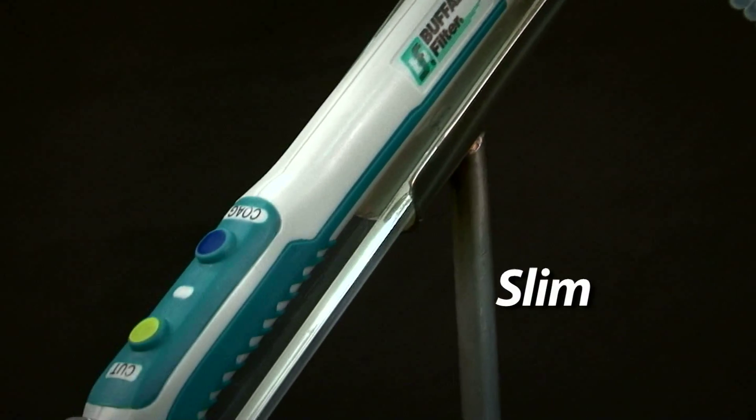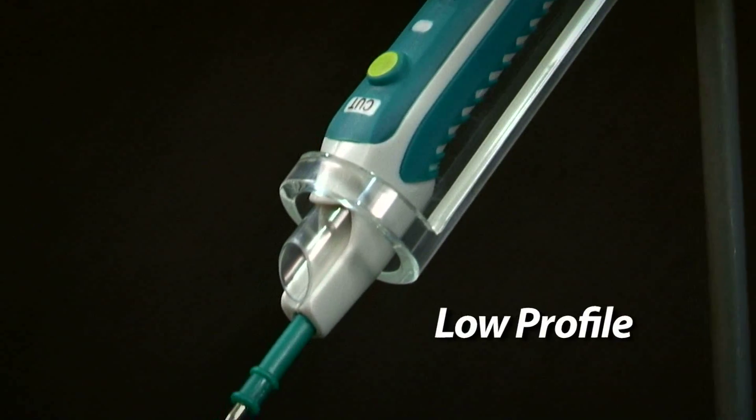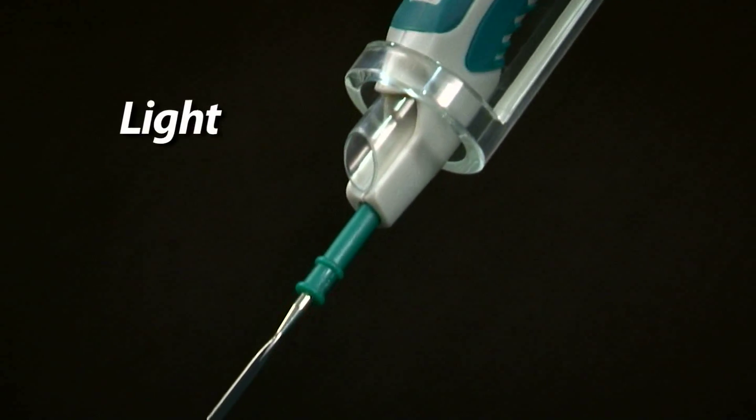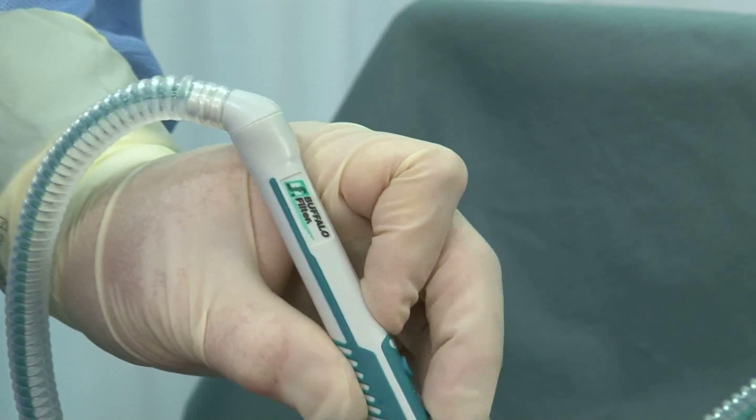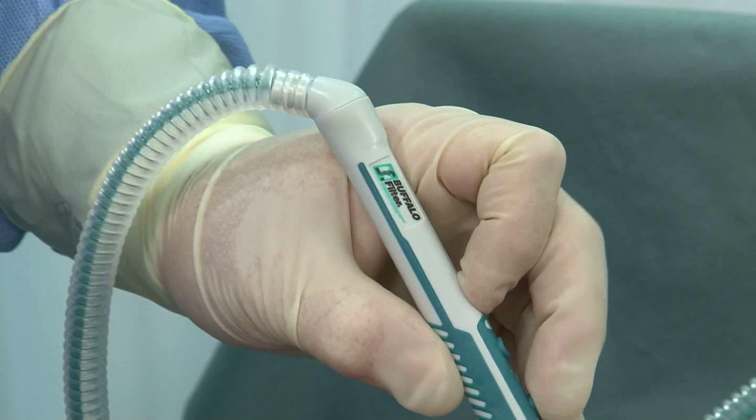Plume Pen Elite features a compact, ultra slim, ergonomic design that is significantly smaller than major electrosurgical smoke pencils. Designed for surgeons by surgeons, Plume Pen Elite delivers a unique set of features unmatched by competitive electrosurgical pencils.